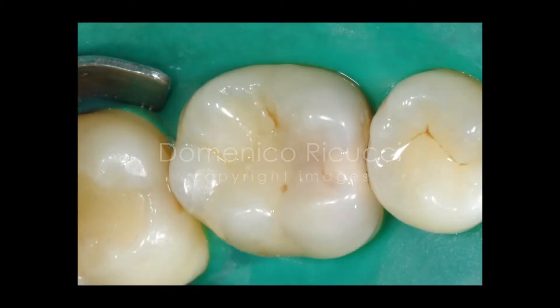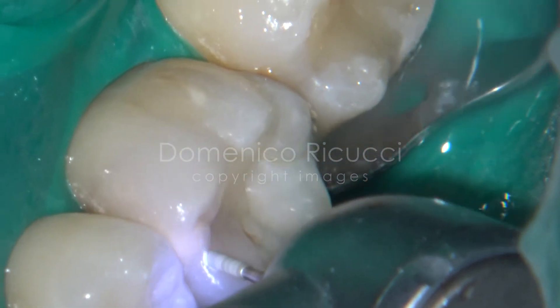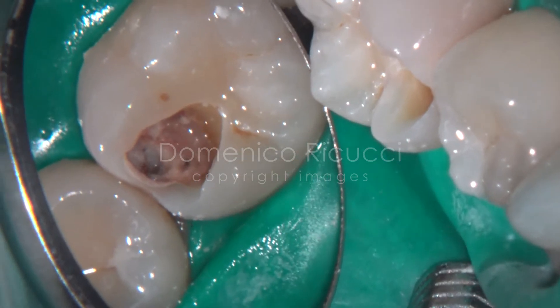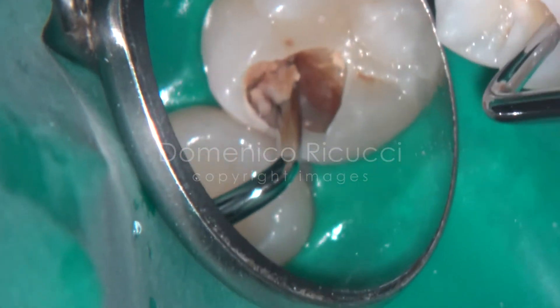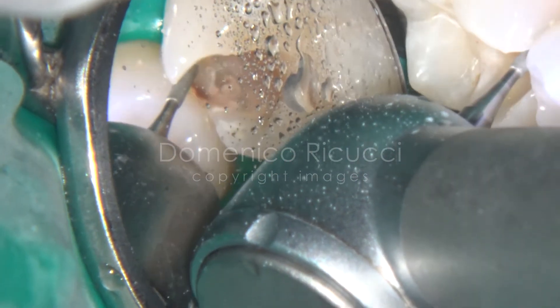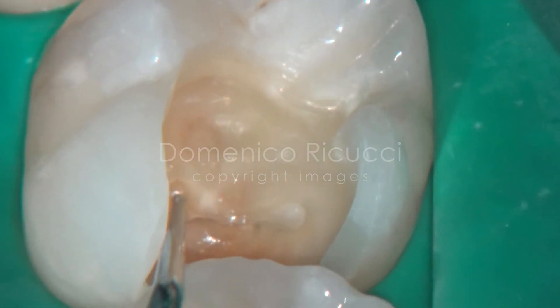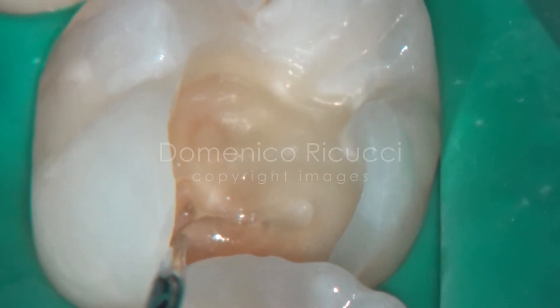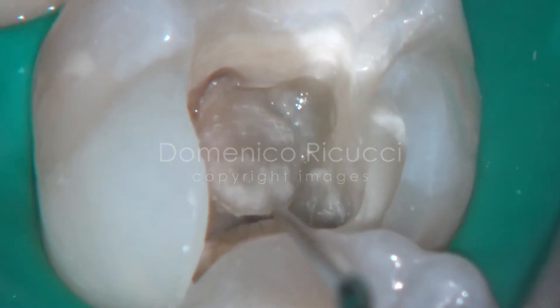After rubber dam isolation and field disinfection, the mesial caries is accessed. The soft tissue is excavated and the mesial unsupported enamel removed. After thorough cleaning of the cavity, necrotic avascular tissue is observed through the exposed pulp horns. The pulp chamber roof is separated with ultrasonic tips and removed.